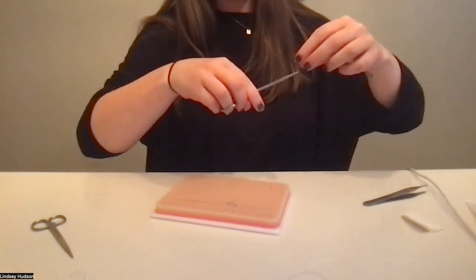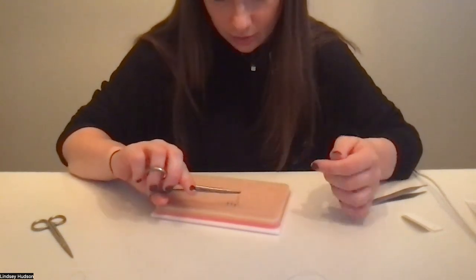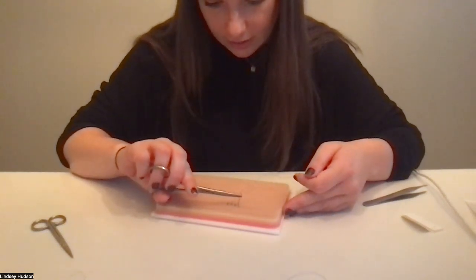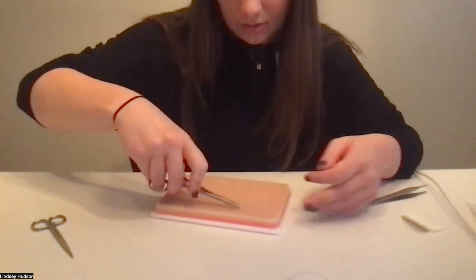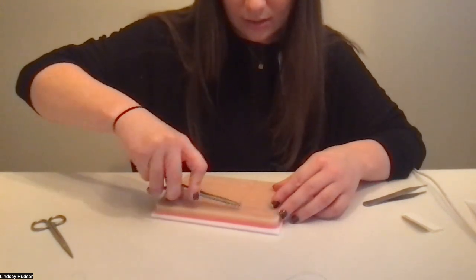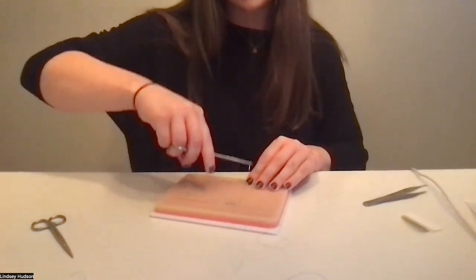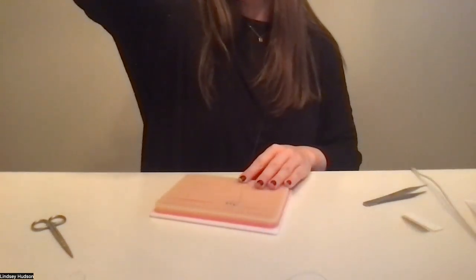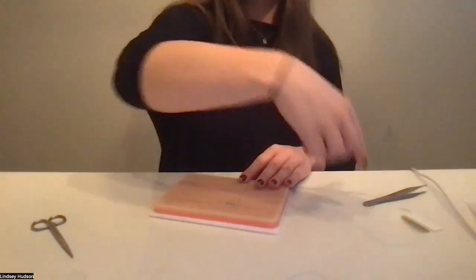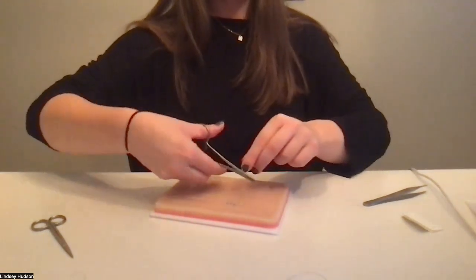And go in for suture number 4. About 10 millimeters or so away. 90 degree angle. Twist the wrist to come through to the other side and pull it. Right, over 2.